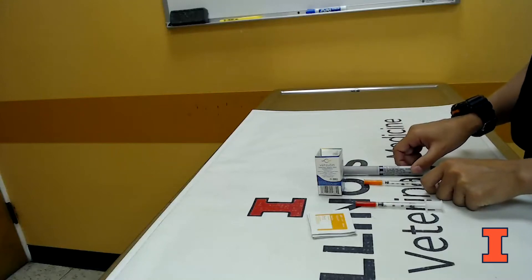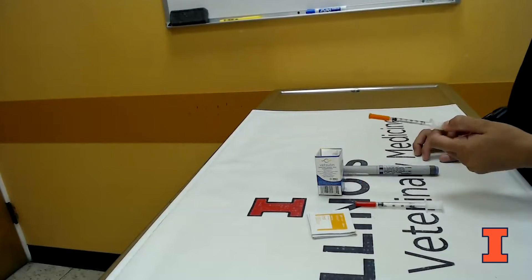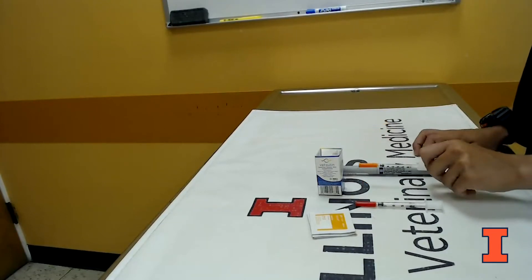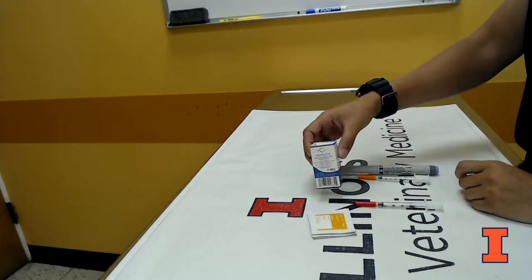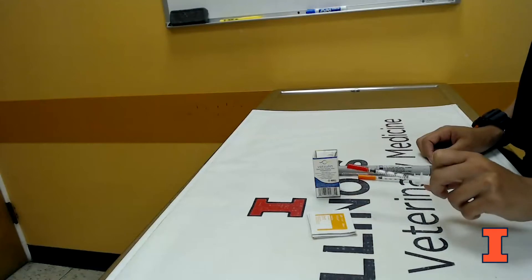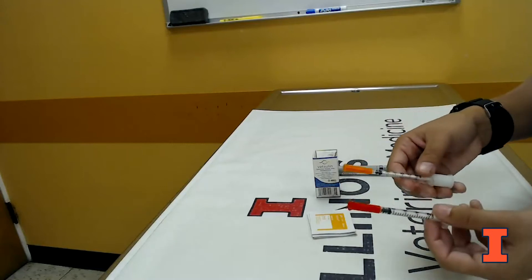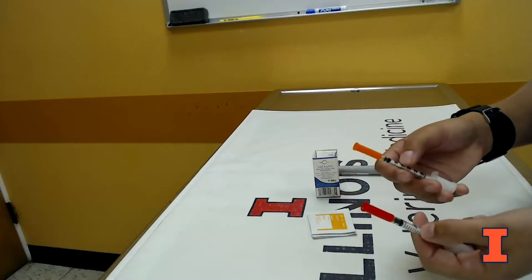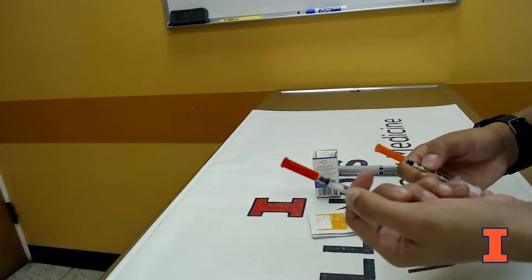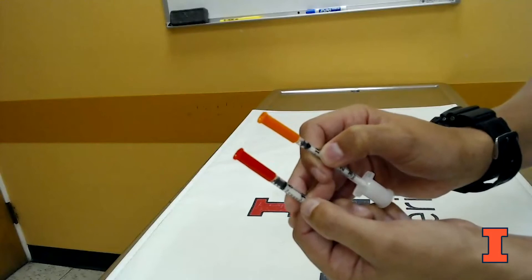Lantus is a U100 insulin, meaning 100 units per mil, which means we will use an orange-capped U100 syringe. We'll also talk about Vetsulin, which is commonly used in veterinary medicine but is a U40 insulin — 40 units per mil — and we're going to use a red-capped U40 syringe for that one. It's important to know the difference, because 10 units on one syringe is a very different volume than 10 units on the other.